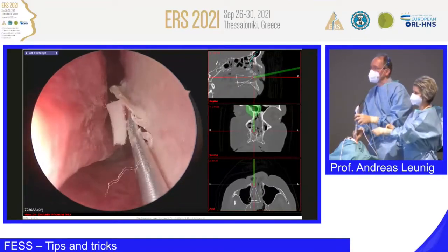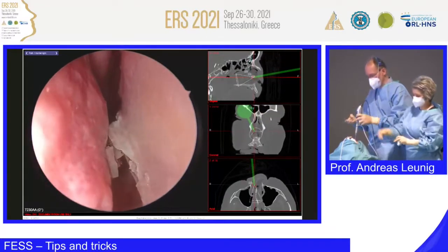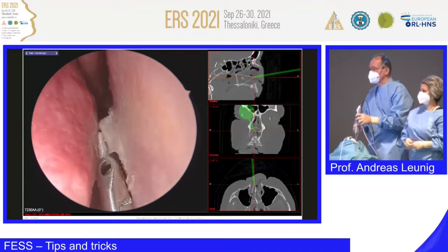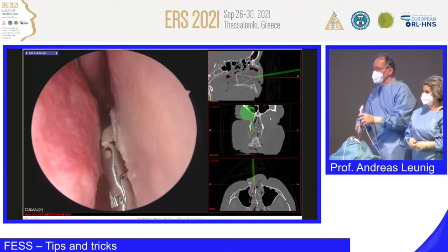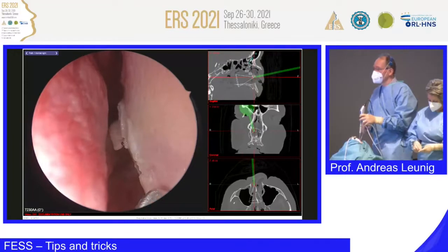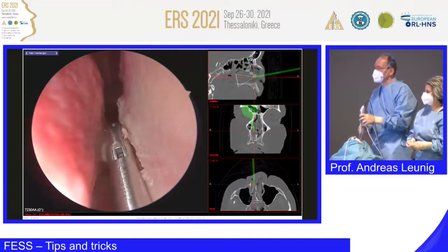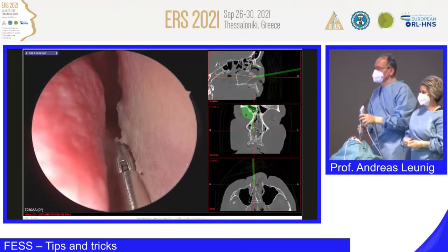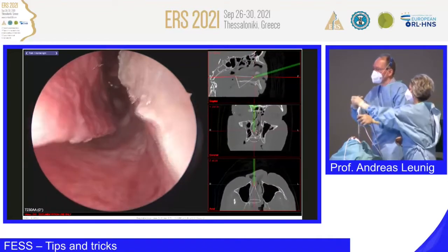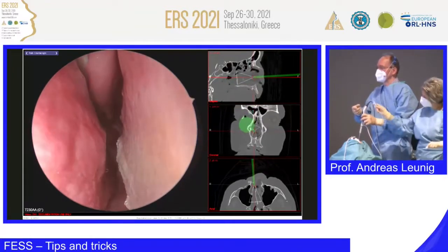Yeah, we have usually a very tiny Blakesley. It's called Strümpelchen. It's from the ear surgery. But we don't have it in this collection. But this helps you in very narrow spaces even to work very, very atraumatic. And this is very important in this kind of surgery. I take it away. I mean, it's not a very difficult procedure here, but it should show you, you can do even septum surgery with really less traumatization. Please, Joseph again.